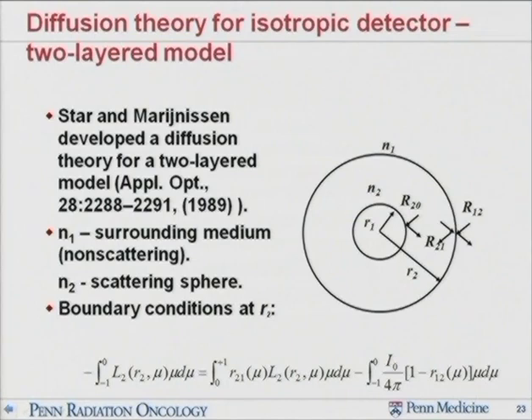an isotropic detector considered to be an isotropic sphere that only contains highly scattering medium with a mu s prime really, really high, and index of refraction N2. The surrounding medium has the index of refraction N1, and optical properties are the absorption coefficient mu a and mu s prime, an arbitrary number. So the important thing is, if you have a known quantity of irradiance coming into the sphere, how much of this gets into this inner core, which is where the fiber is.